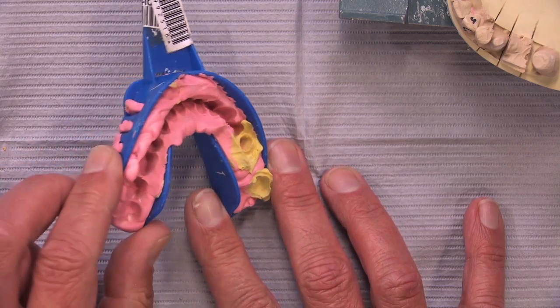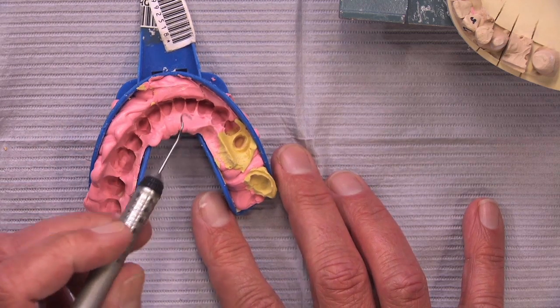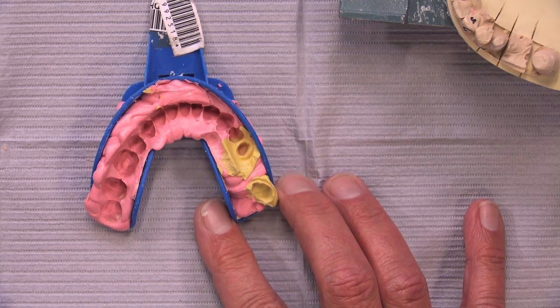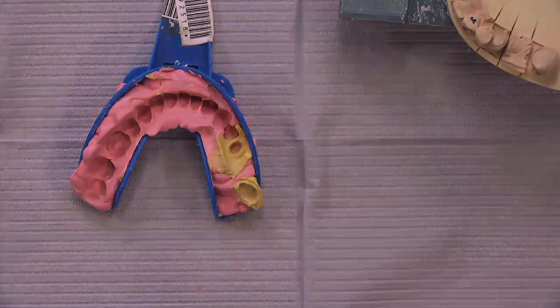So the preps themselves look really good. I've got no issues with the preps themselves. When we adjust that opposing, we'll get a little extra space for the BruxZir bridge over here, but a new impression will go a long way to making this case something that's going to be successful for the doctor and the patient as well.